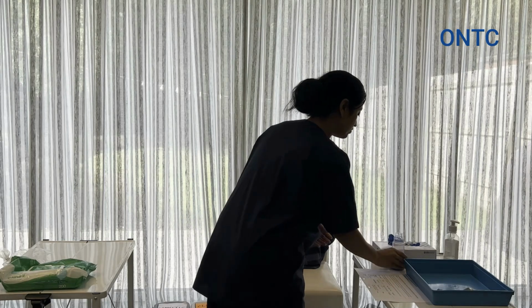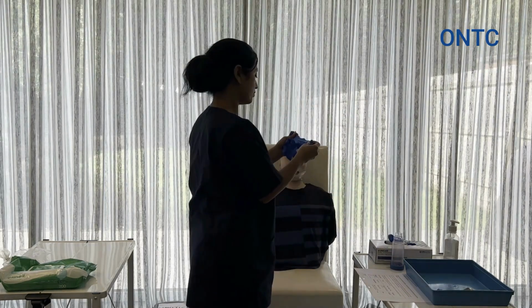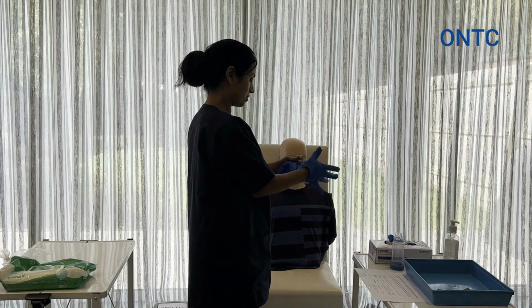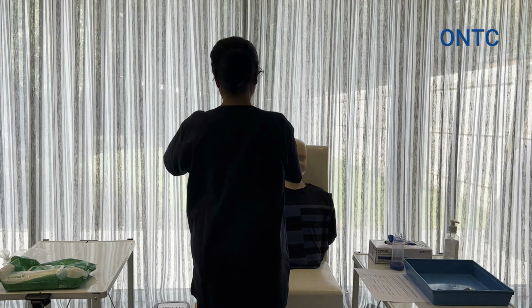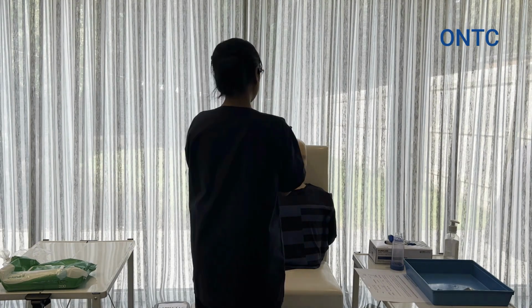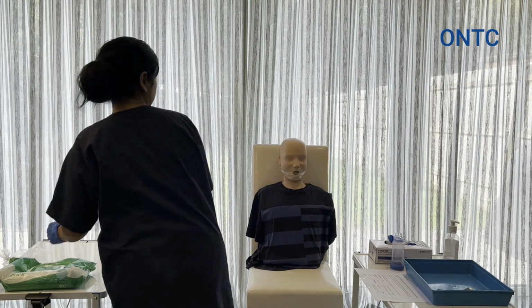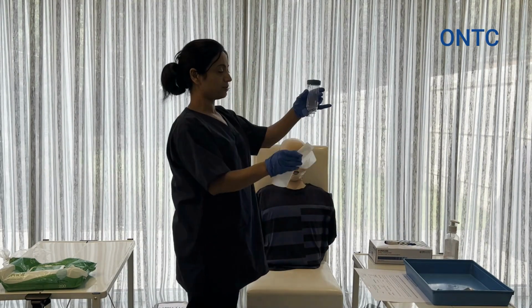Okay, I'm just going to clean it for you to take home. So this is for you to take home, so you can use this to take your inhaler at home. So just going to put some gloves on. Okay, we're going to now wipe this using a cleaner wipe, which they have already told me is ready and clean and ready to use. So I'm just going to clean it from the cleanest to the dirtiest.